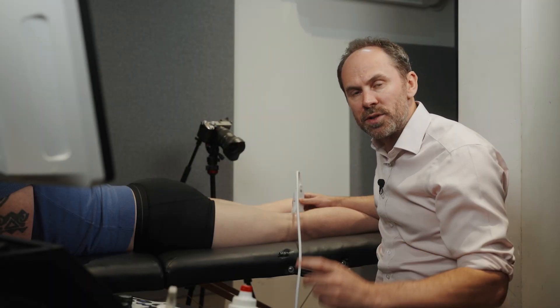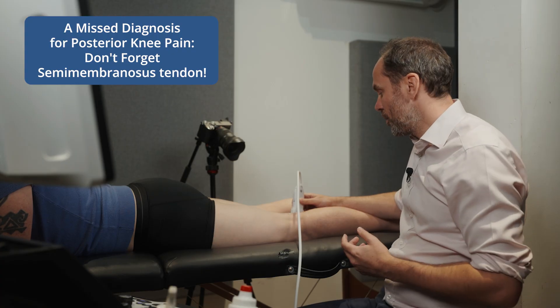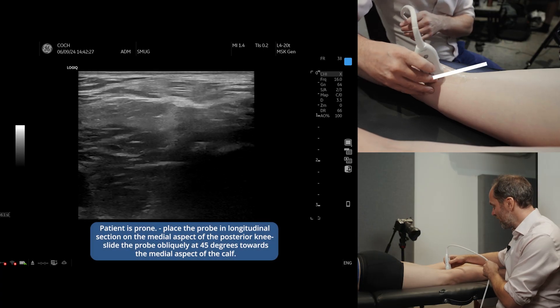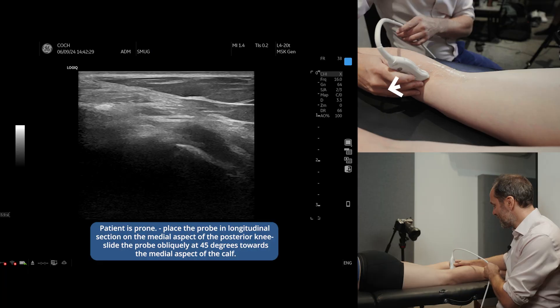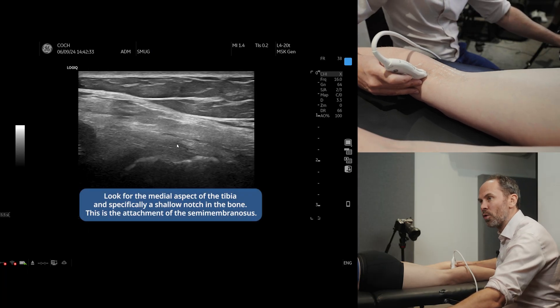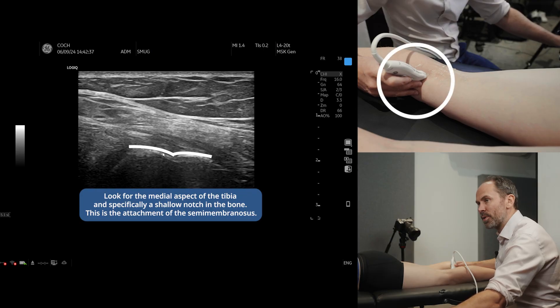Here's how you find the semimembranosus at the back of the knee where it attaches onto the tibia. With the patient prone, go in long section and slide the probe into that little space on the medial aspect of the tibia. You're looking for this little dip — this is your landmark, this little dip in the tibia.